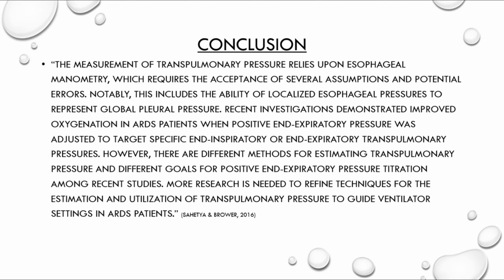So in conclusion, these pressure readings rely on esophageal manometry. We're assuming several things, and there's a lot of potential errors in these readings. Again, that brings to mind that not all diseases are affected evenly or symmetrically across the lungs.